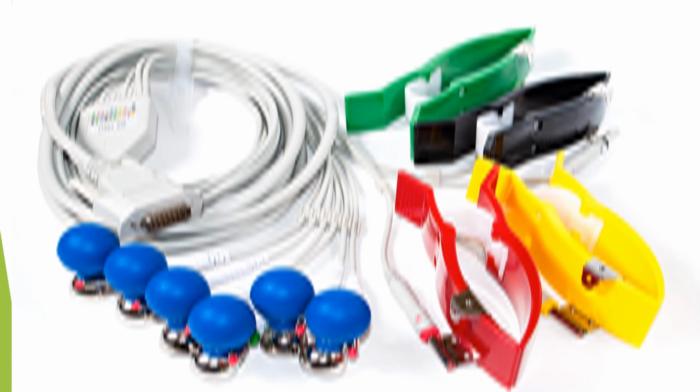This picture shows the electrodes of a 12-lead ECG, and it includes 6 chest electrodes and 4 limb electrodes, total 10 electrodes, and we are getting 12 ECG leads from these 10 electrodes. So the 12 leads of ECG represent 12 different electrical views of the heart. So the ECG records 12 leads, producing 12 separate graphs on a piece of ECG paper.